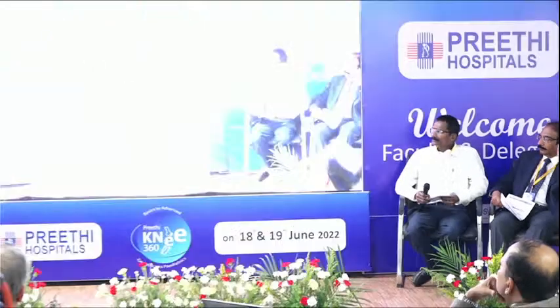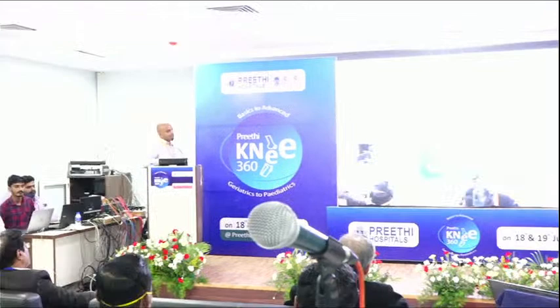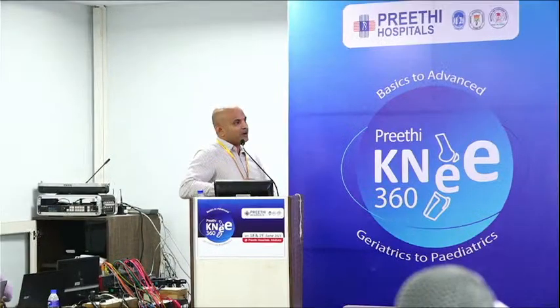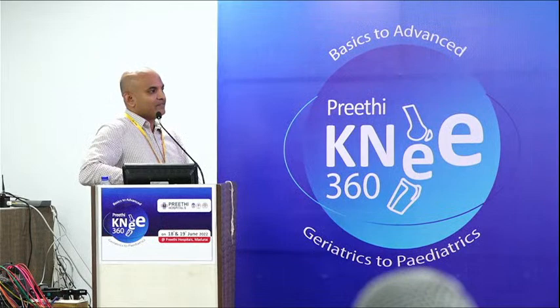No, sir. We don't. What we feel is that if you are using a poly of more than 15 or something, that means that you have not balanced it right. And one more thing is that we use these small stems only in very obese patients, 35 and above. First we did 40 and above. Now we have decreased it because we wanted to see how they fare over a period of time. But poly per se as an indicator to use a stem, no. We haven't done anything like that in our patients.